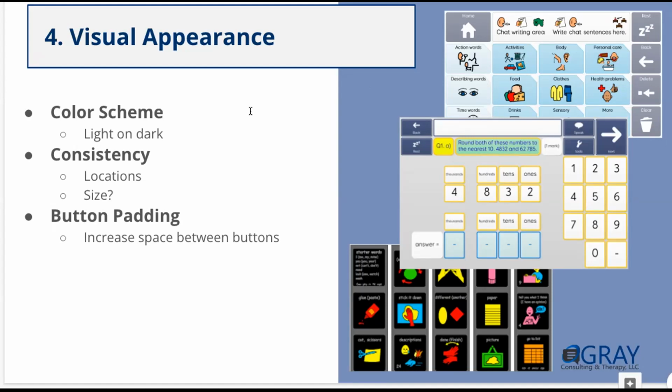You've got these different levels and layers, and some work better for people than others. A lot of people complain that the high contrast symbols are actually more challenging for them to see and interpret than the more traditional ones. So sometimes just going with a nice dark navy or a dark gray background with your more traditional symbol set can make a huge difference.